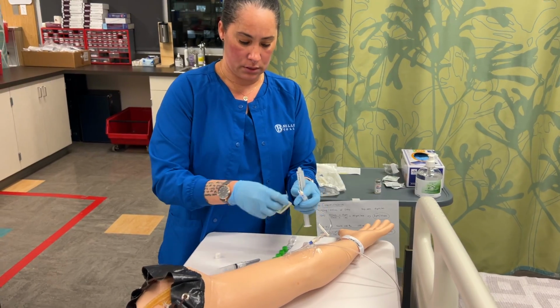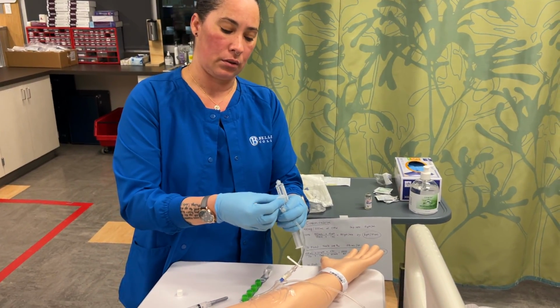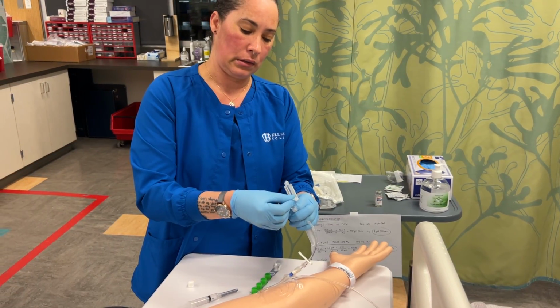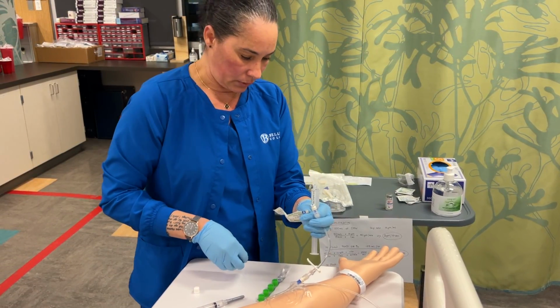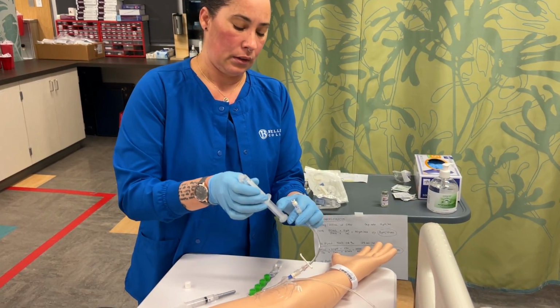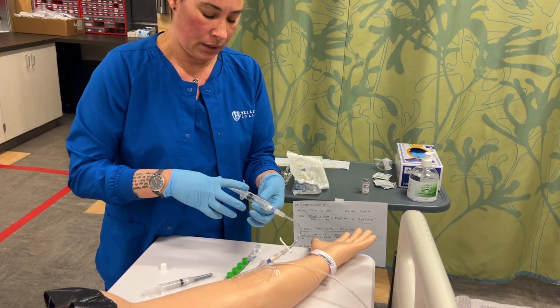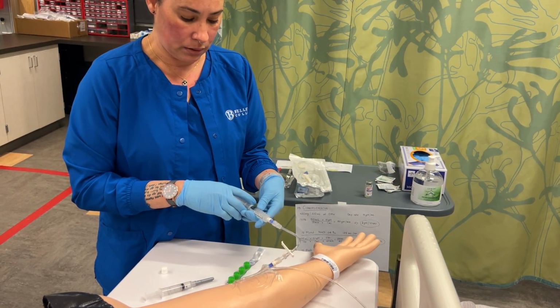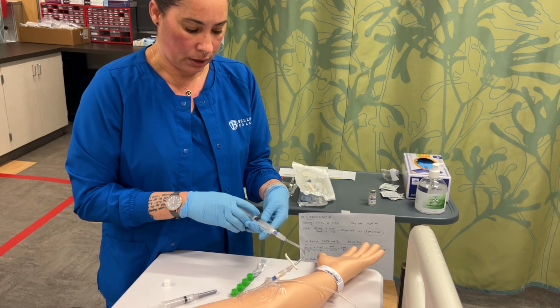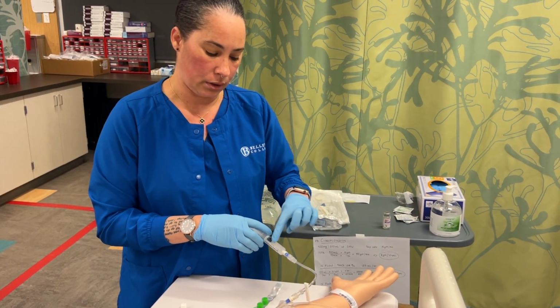alcohol wipe this one. Just want to make sure everything's clean. You don't want to put anything dirty in there. All right. And again, for 15 seconds, let it dry for 5. So we're going to attach this to the patient's port. And you're just going to put half of this in. Checking for the, oh, we're going to unclamp it too. That's important. So unclamp it, and then you're going to go halfway.